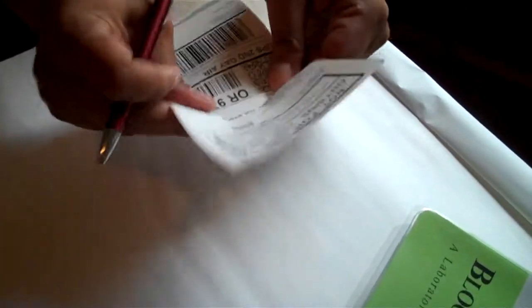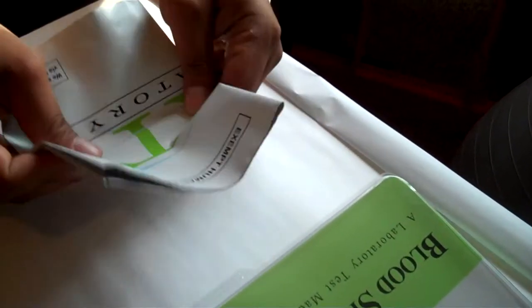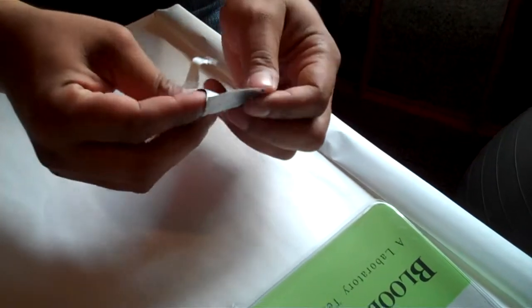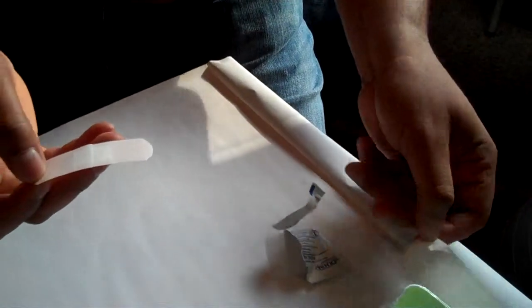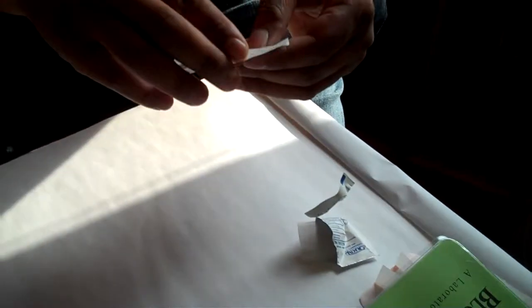This is your shipping label — set that to the side. There's also a little more information you won't need, and this gives you guidance on your collection instructions. Open that up — it gives you a few guidelines on how to go about collecting your sample. This is what you're going to put your completed specimen in. Go ahead and open up the alcohol pad and clean off your finger. Open up the band-aid as well — you'll probably need this if you get a good stick.